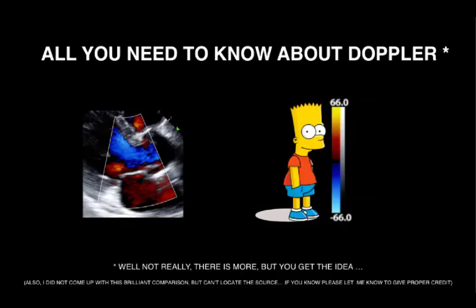last formal component of this assessment, which is to look at the valves. Have a quick glance at the performance of the valves that you need in order for your heart to have a proper stroke volume. So what we're really doing here is assessing for clinically significant valvular pathology. And you might say, well, valvular pathology is beyond the scope of emergency physicians. Sure, it's true. But if you put simply color and understand the basics of Doppler, you will pick up severe and clinically significant valvular abnormalities. This is really all you need to know in order to identify valvular abnormalities.